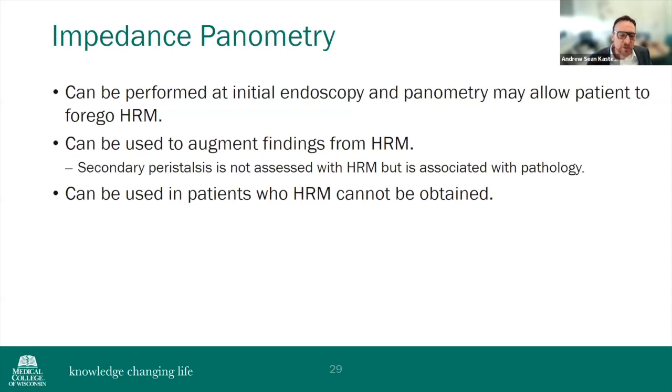And then there's patients who you just can't tolerate manometry for different reasons. And so that's another spot where this can be used.